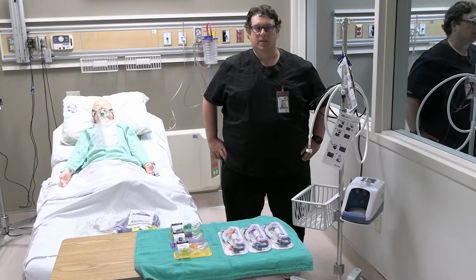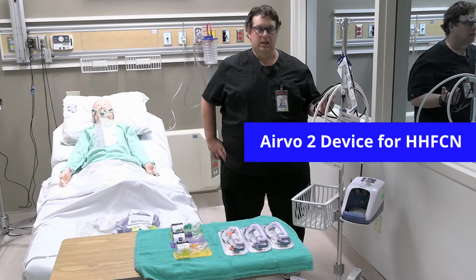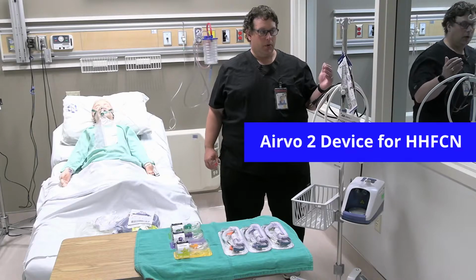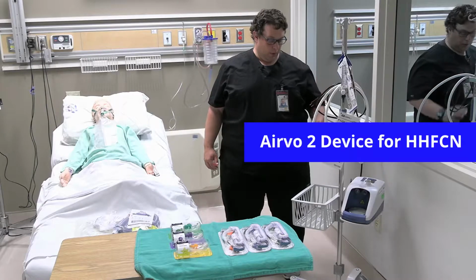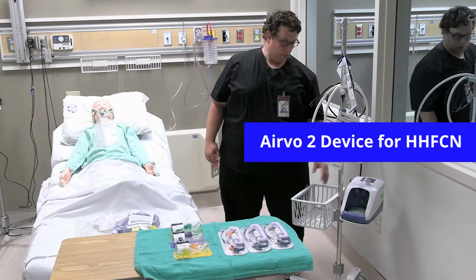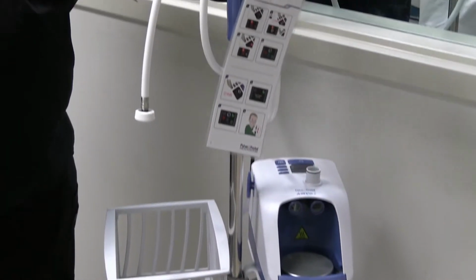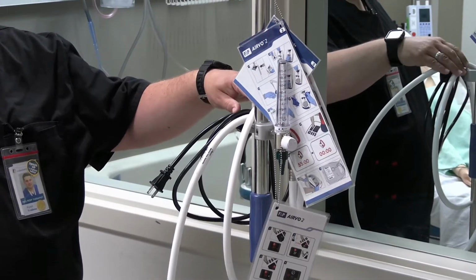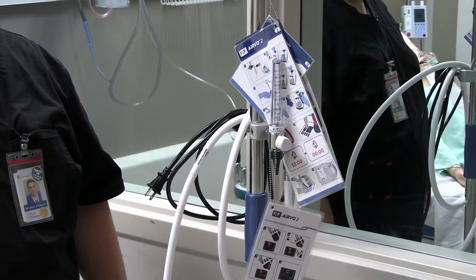Next, we're going to talk about Heated Hi-Flow Nasal Cannula therapy. And the typical way of delivering this is using the AIRVO 2 device. And your typical AIRVO 2 device comes set up with a storage basket, your actual AIRVO device here, an IV pole with an attached flow meter, high pressure oxygen tubing, and then your plug for your AIRVO device here.